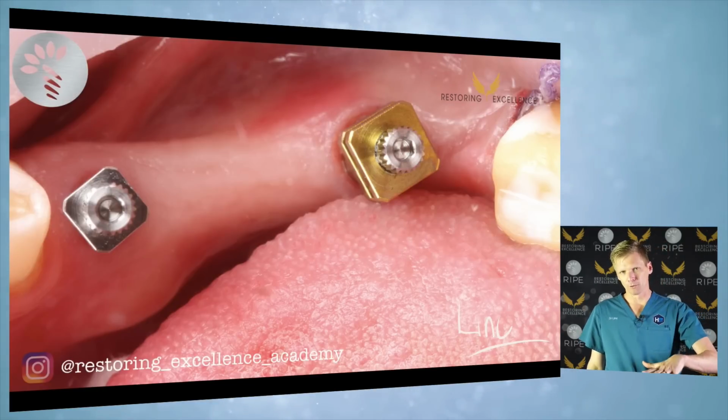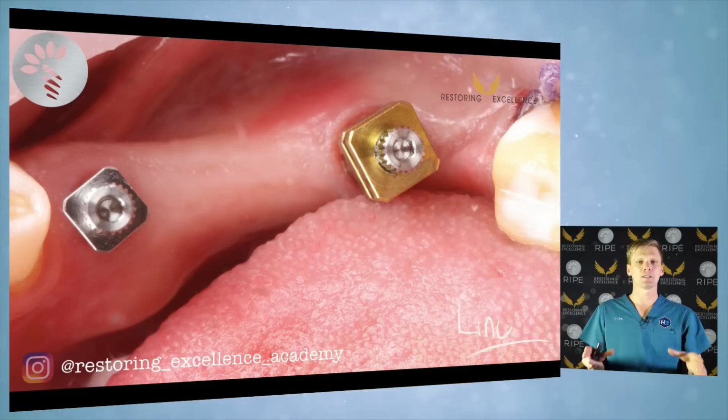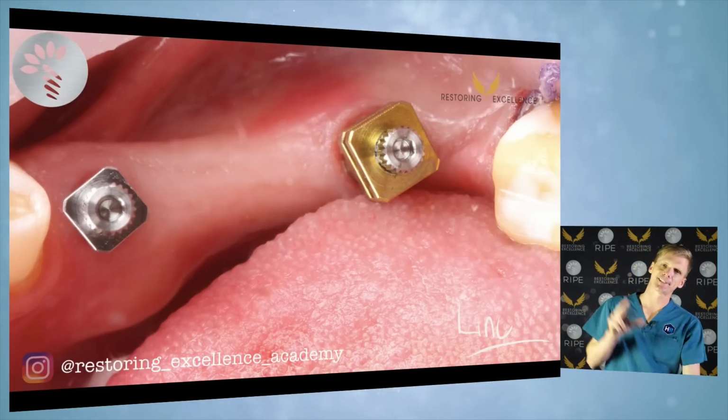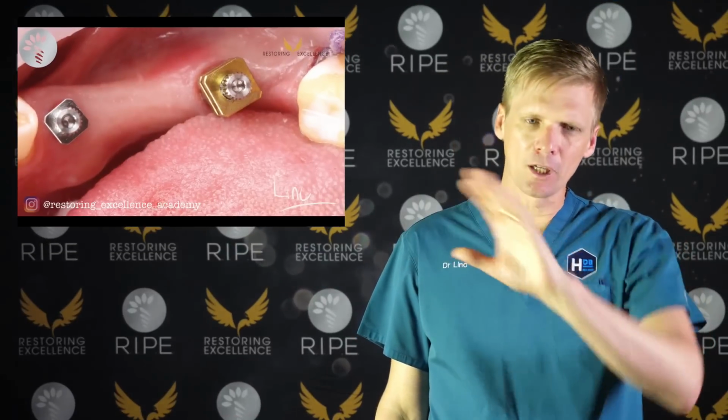Now, what's important with trays is most of the time I'm using a tray that's not perforated. You want a tray that is solid because it compresses the silicone in better. So for something like this, okay, we go through.